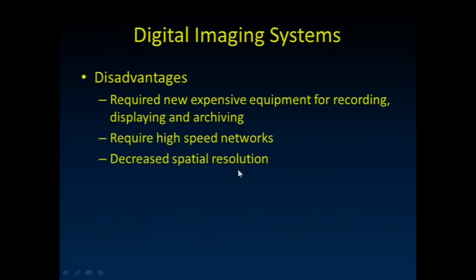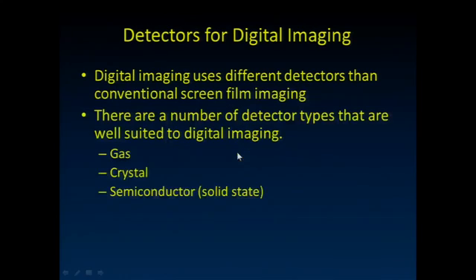And they do have decreased spatial resolution compared to film. Some people thought that may be prohibitive in terms of their use, but that really hasn't been the case as we've gotten better and better resolution digital imaging systems. Still not quite the same as screen film, but getting closer to doing that.